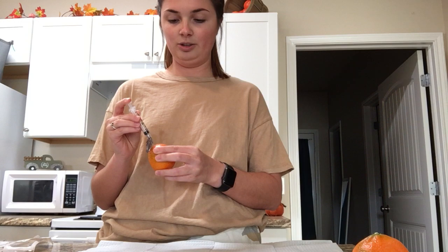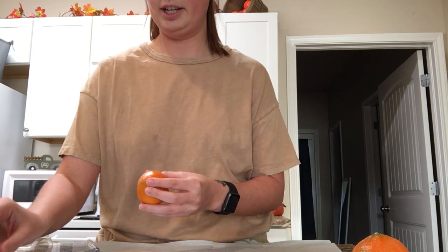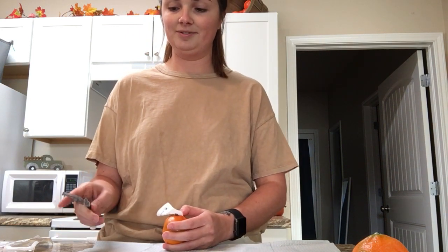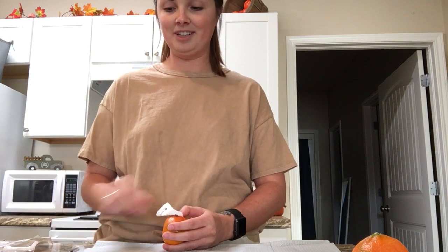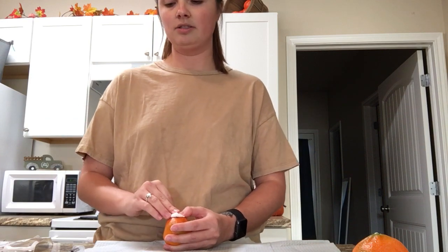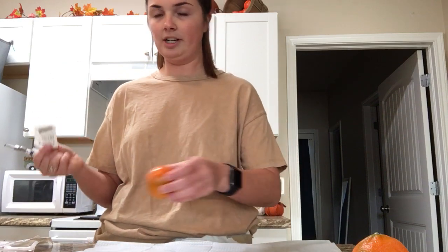And then I'm going to hold it there for just a second, make sure it goes in, take the needle out, and then I'm going to grab a cotton ball and hold pressure over the injection site to make sure it stops bleeding. And I'm going to flip this up immediately after I give the injection. So I'm going to hold pressure on there, or I'm going to put a Band-Aid over it, whichever. And then I'm going to dispose of the needle in a sharps container.